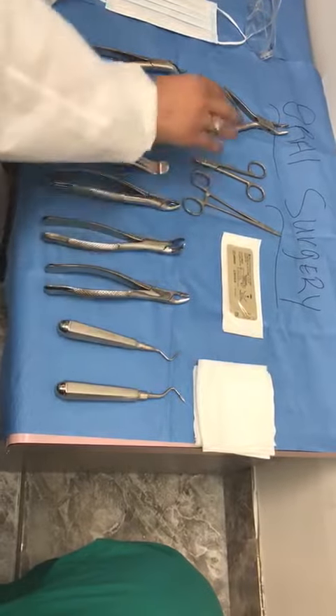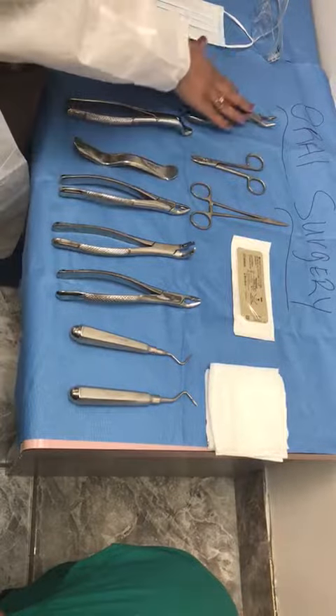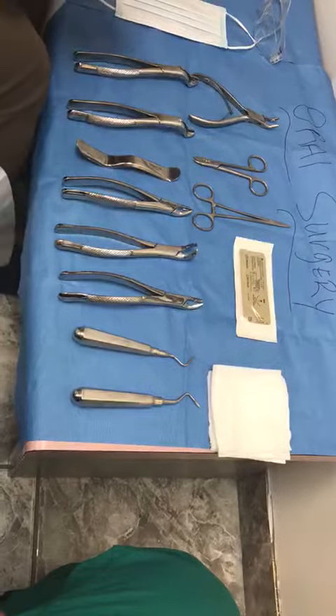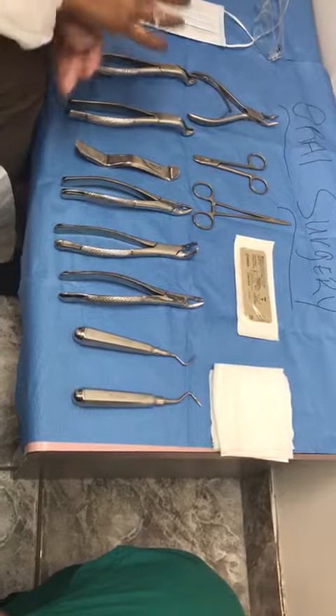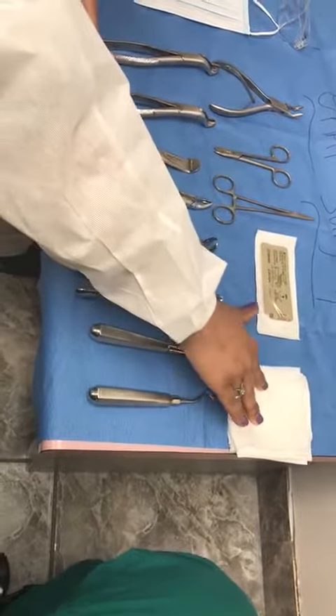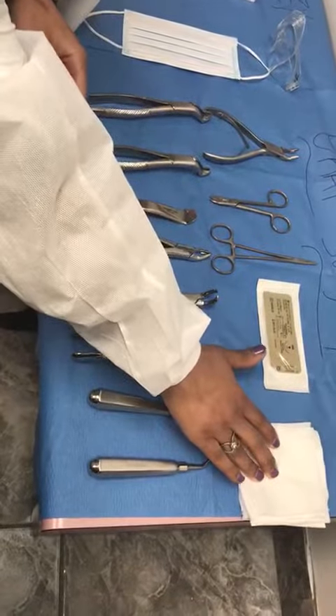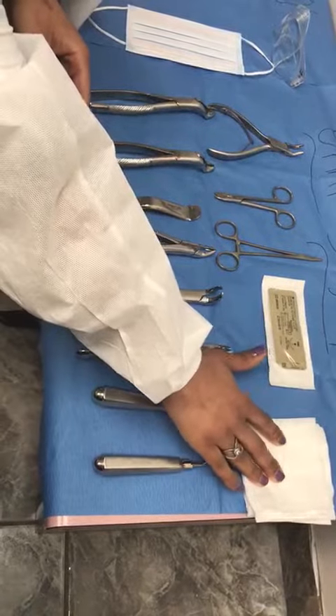This tutorial is on an oral surgery setup, basically identifying different types of oral surgery instruments. Here is a 4x4 gauze — we use this to put in the patient's mouth, towards the back of the throat, so when they are extracting teeth they won't swallow the tooth.